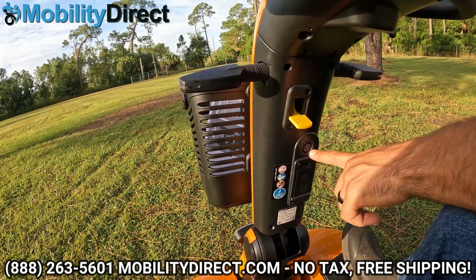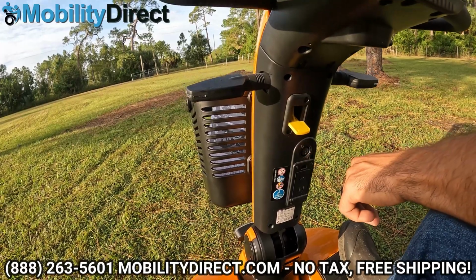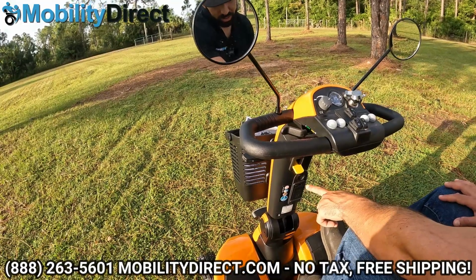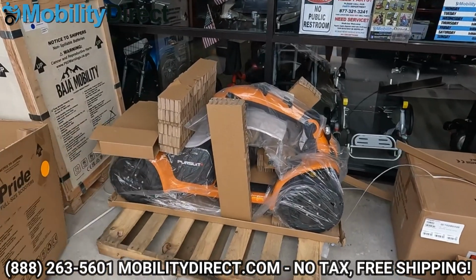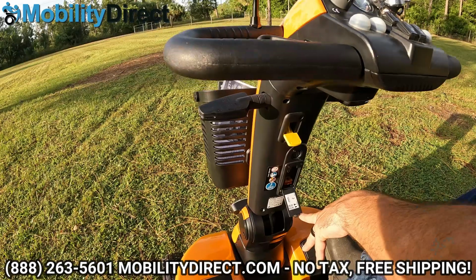Make sure you charge your unit overnight when you first get it. We do have an unboxing and assembly video. You can click on the link at the top right-hand corner of the screen that says unboxing video to see the process and know what to expect if you order one. It will show up in the box with minimal assembly required. So check that video out if you want to learn how to take it out of the box and set it up for the first time.